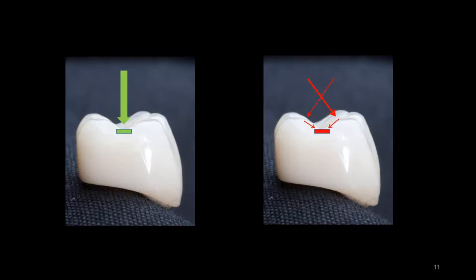The issue that we have is the hidden slide. The issue is when it touches, hits the incline of the tooth and slides into position. I'd like to share this with you. We are asking a patient to bullseye land centric every time when we say touch your teeth together. I'd like you to now consider that most of the denture work we do is for senior citizens and for the elderly.